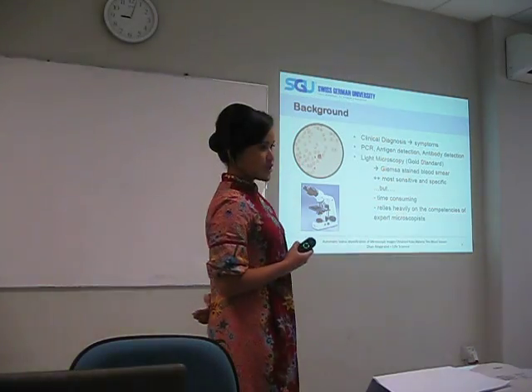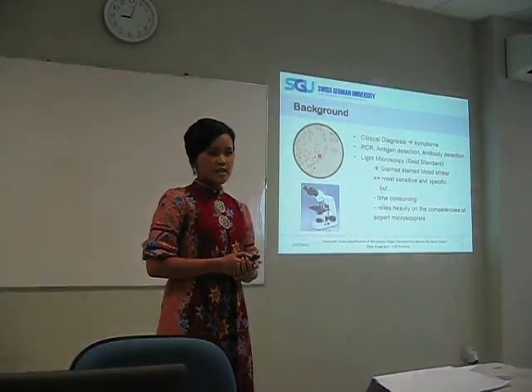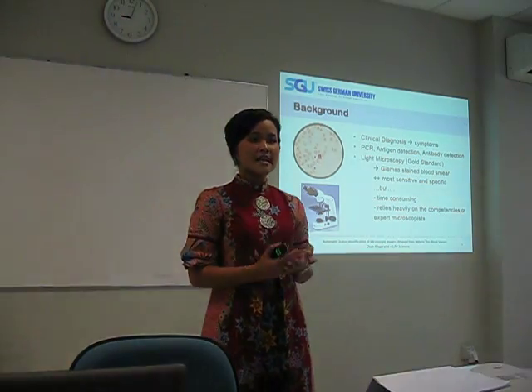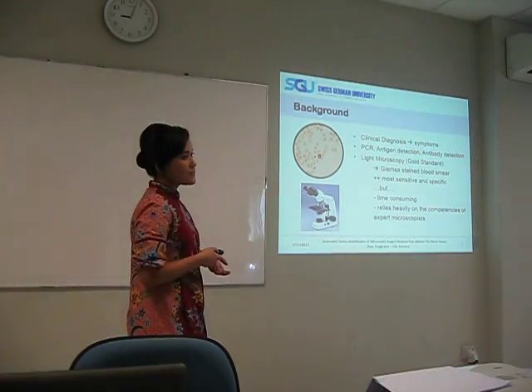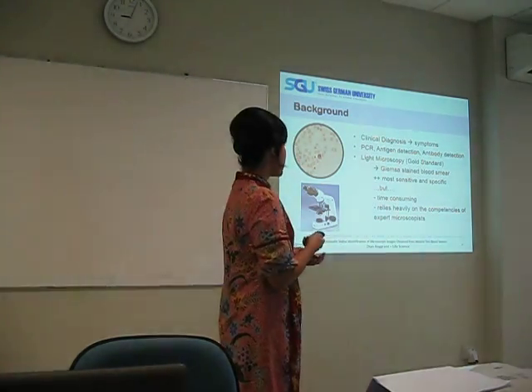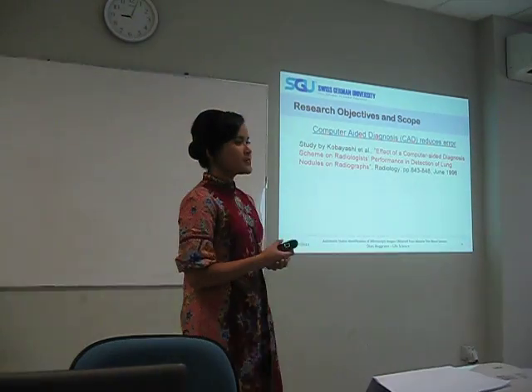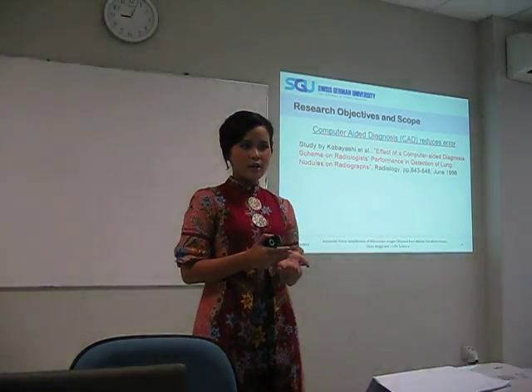Furthermore, the World Health Organization recommended that the key to overcome global health problems caused by this disease is accurate diagnosis. Among different techniques utilized for diagnostic purposes, examining Giemsa-stained blood smear under a light microscope is believed to be the most sensitive and specific one. However, this method is very time-consuming and prone to error since it relies heavily on the expertise of the microscopists. One way to overcome the drawback of microscopy is through a computer-aided diagnosis system that has been proven to help reduce error. Therefore, a lot of research efforts have been put into developing such systems.